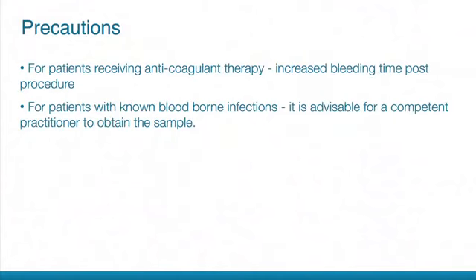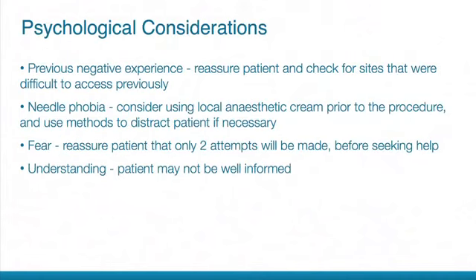The following precautions should be observed during the procedure. For patients receiving anticoagulant therapy, there will be an increased bleeding time post-procedure. For patients with known blood-borne infections, it is advisable for a competent practitioner to obtain the sample. There are psychological considerations that should be taken into account in some patients.